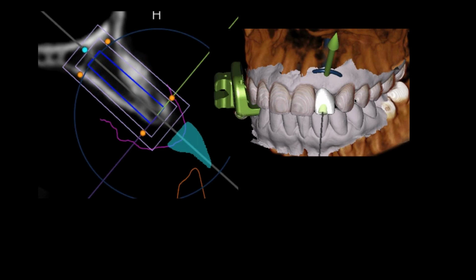And then we take this image and we superimpose it on the CT scan, and then I place a fake lateral in there, a virtual tooth. Now what you're seeing here is the first lineup of an implant. This would tell me, if we left it like this, that this would have to be a cemented restoration because of the way it's coming out. It's very hard to do this restoration screw-retained.